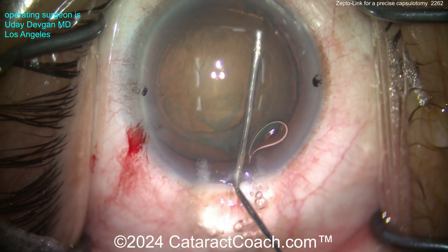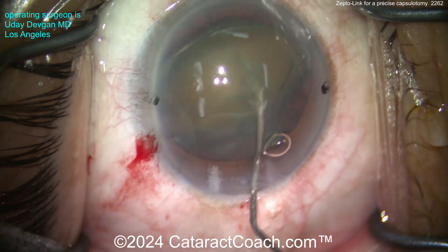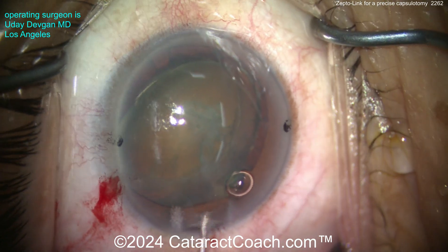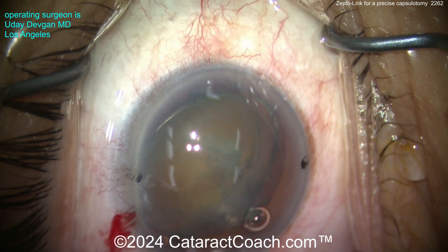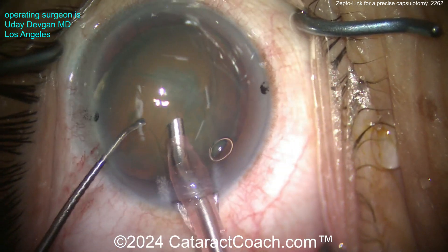I'm going to prolapse the lens out of the bag. The capsulotomy is strong — much stronger than what you'd get from a femtosecond laser, so in that sense it's better than a femtosecond laser. Now we're going to go inside. You can see the nucleus is tilted up out of the capsular bag — phaco probe and chopper on the other hand.